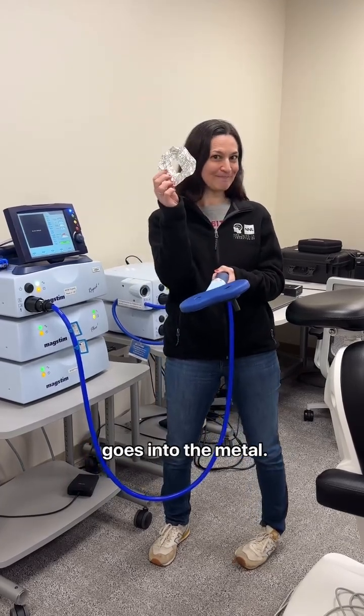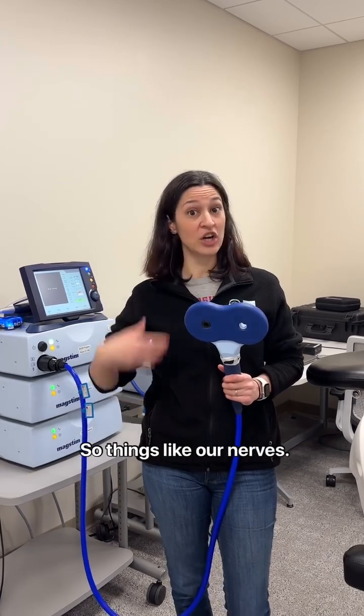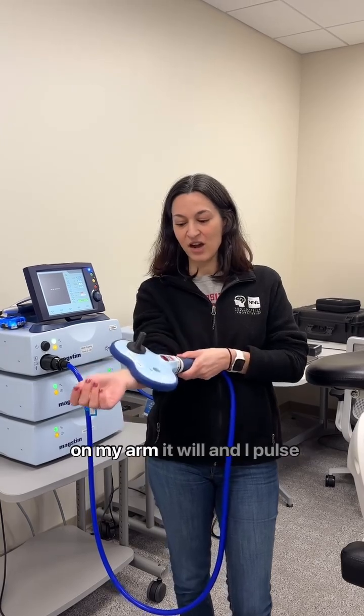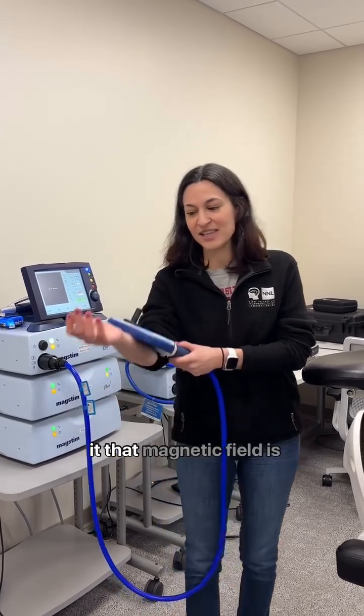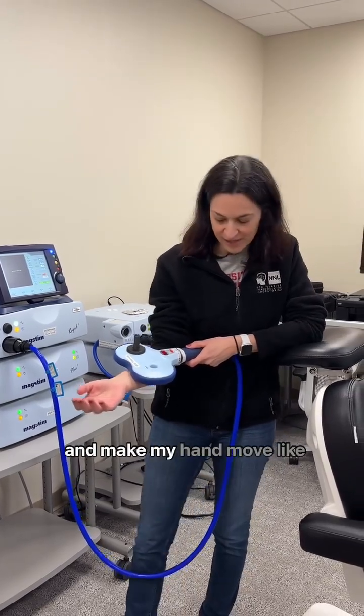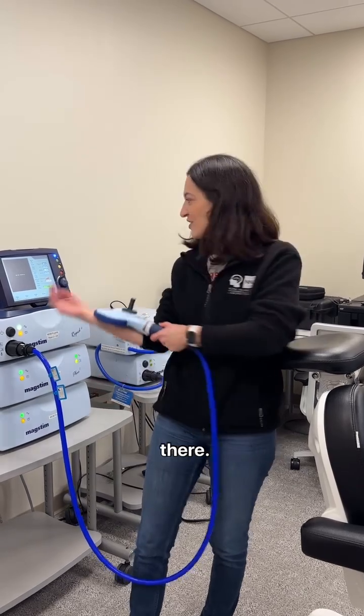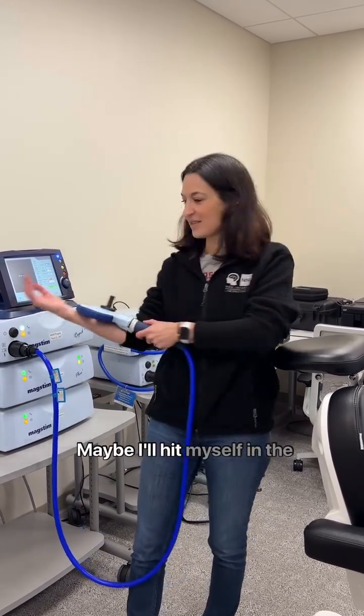The cool thing is that cells in our body communicate with each other using electricity — things like our nerves. So when I put the TMS magnet on my arm and pulse it, that magnetic field is going to make the nerve cells in my arm talk to each other and make my hand move. You can see that finger moved a little bit — let's crank it up.